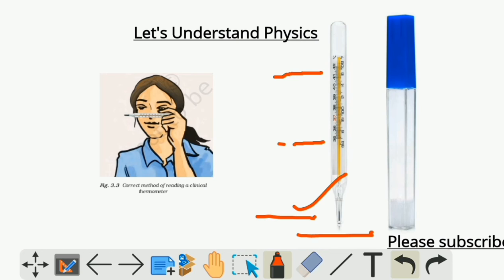Now, when you are storing it, there will be a glass bottle like this with a cap. Keep it safely in this. Keep it out of reach of children and don't hit it against hard substances, because it is glass, right? It may break. Then precautions while reading. When you are reading the mercury, which has expanded here, it is to be read with the mercury line along the side of the eyes. Understood? You have to keep it straight to your eyes and read the reading.